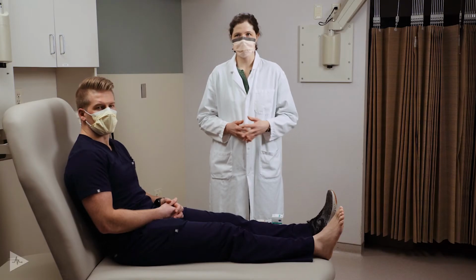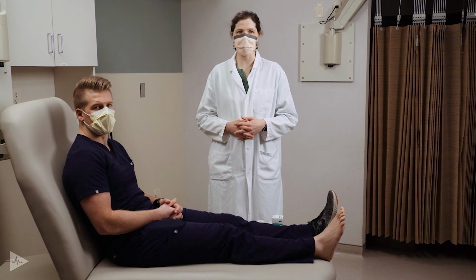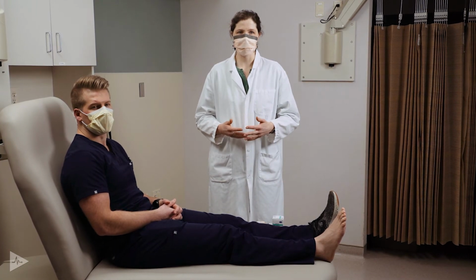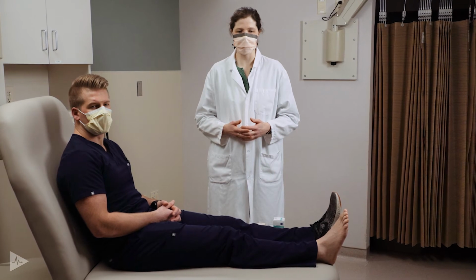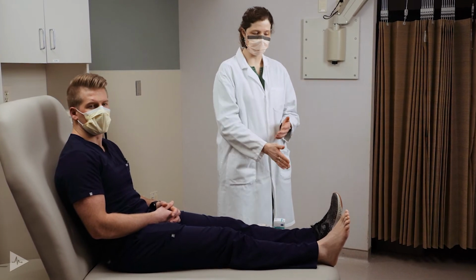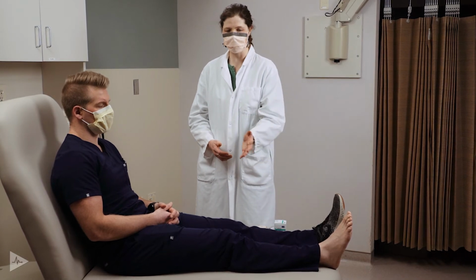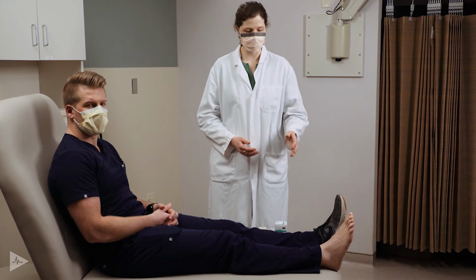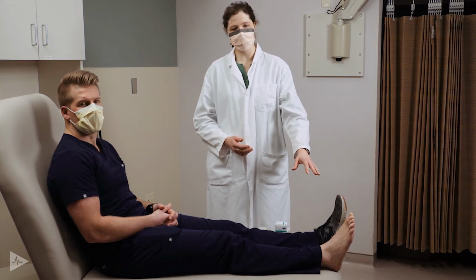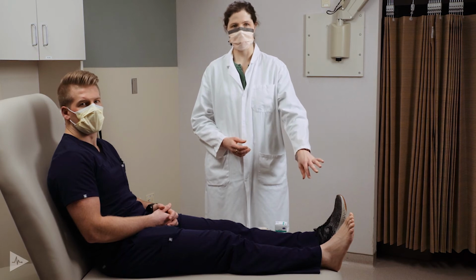Compression can be difficult in terms of patient compliance. It can also be difficult when the patient is managing it at home. So often things that we'll see that aren't quite going as expected for the patient is wrapping from the knee down instead of the foot up, as we want to create a pressure gradient where we're forcing that fluid out of the lower extremity. Patients will sometimes be reluctant to include the foot, which can create some tourniquet effect at the ankle and actually increase edema in the foot.